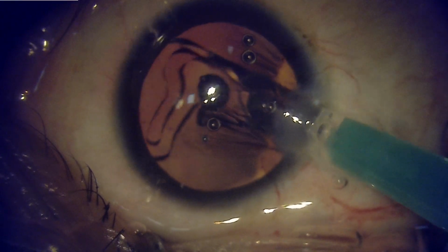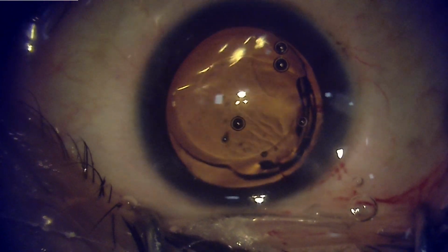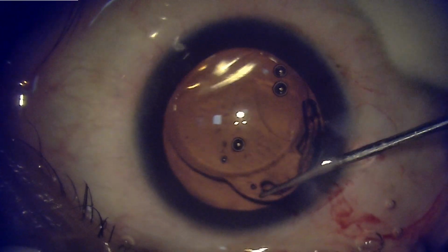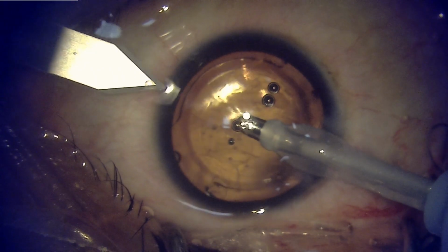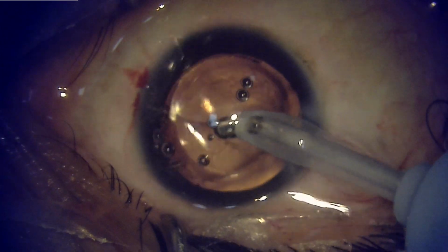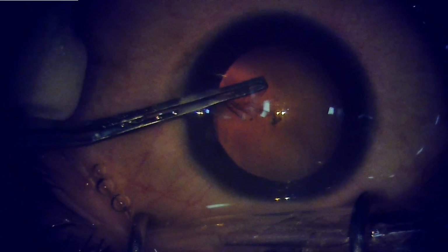Placing in the hydrophilic monofocal IOL, it's a negative power IOL as we have just decided, something like minus 9 diopters. Placing the IOL in the bag, and because this patient also had a corneal astigmatism of minus 1 diopter, flattening of 0.5 by 1 incision, and additionally placing another incision. This is the other eye, and because we did both the eyes in the same sitting, it was a sequential surgery, one after the other.